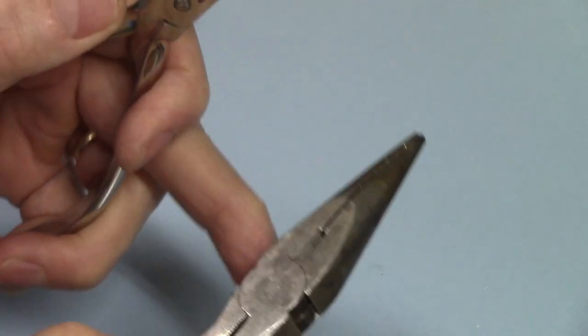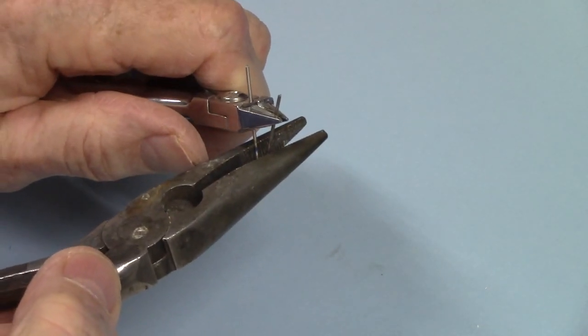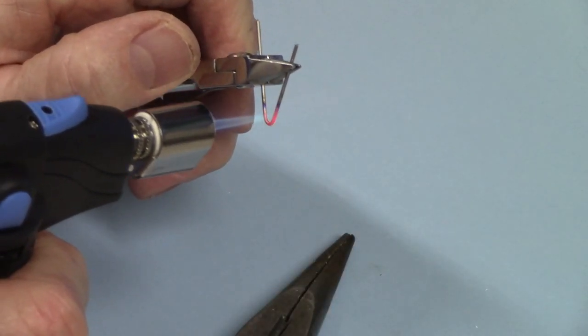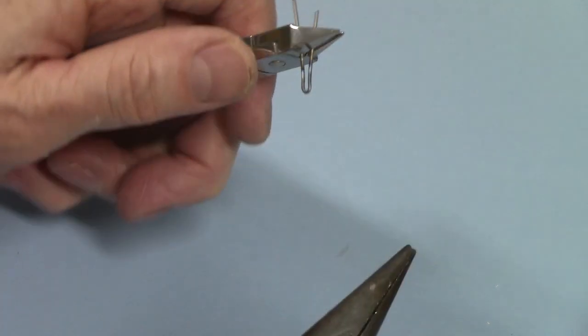It's serrated on both sides — any kind of pliers that are serrated on both sides will work, and the serration is good because it'll really grab it. What I'm going to do is heat it up and then pinch it and smash it. Get it good and hot, and you want to keep that heat confined just to the area that's going to go inside the lingual sheath.